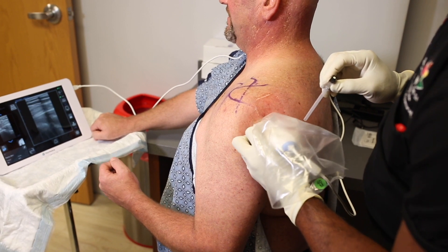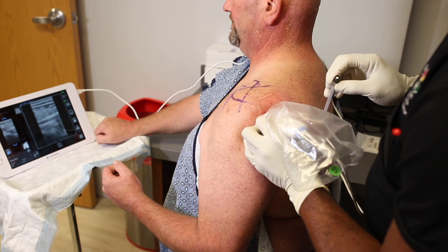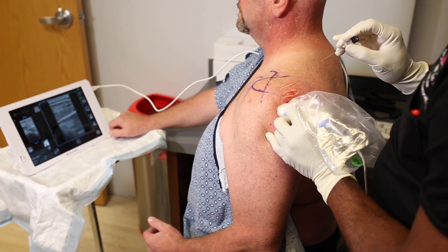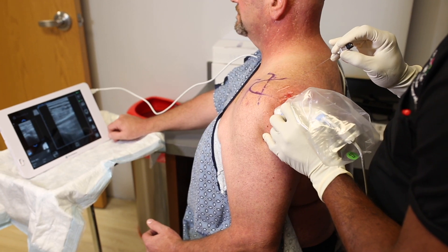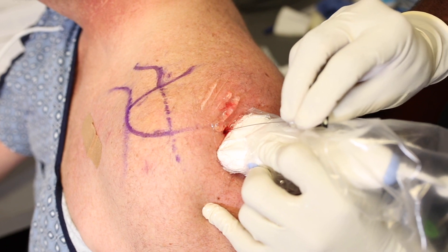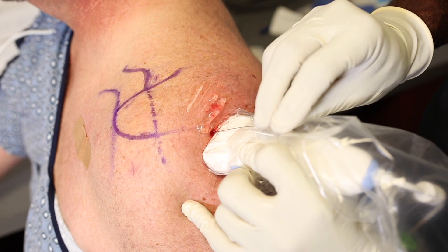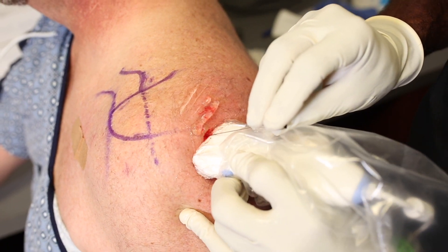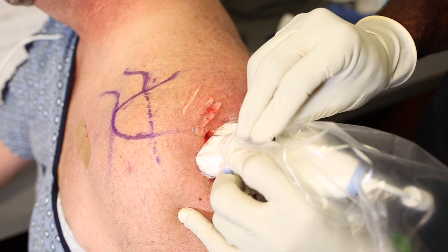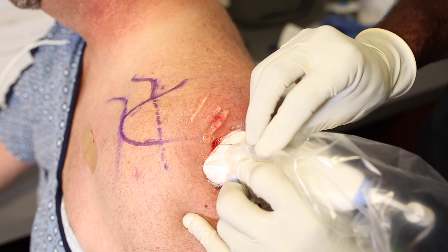Once we have the 22-gauge needle into the joint, we know our path for the MyEye2 needle. We can also gently inflate the joint with a little normal saline to make the rest of the procedure a little easier. We can see the 22-gauge needle going straight down the path of the ultrasound, and we know it's going into the joint because we're looking simultaneously at the ultrasound display. There's no more guesswork with where to place the posterior shoulder arthroscopy portal.